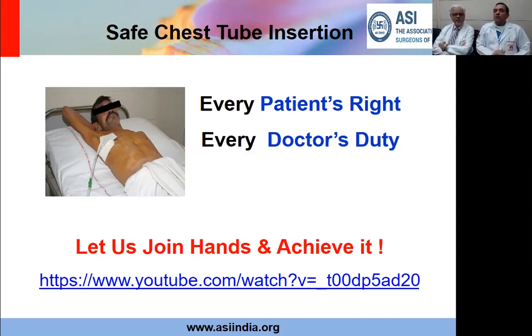Please do not flush a chest tube. There is no role of flushing because you will 100% introduce infection from outside into the chest cavity and you may not even end up opening the chest.